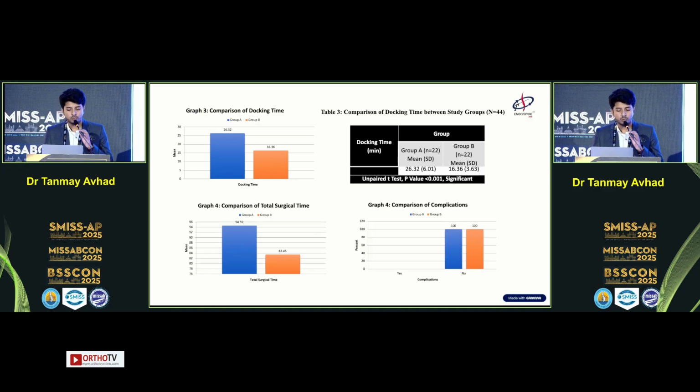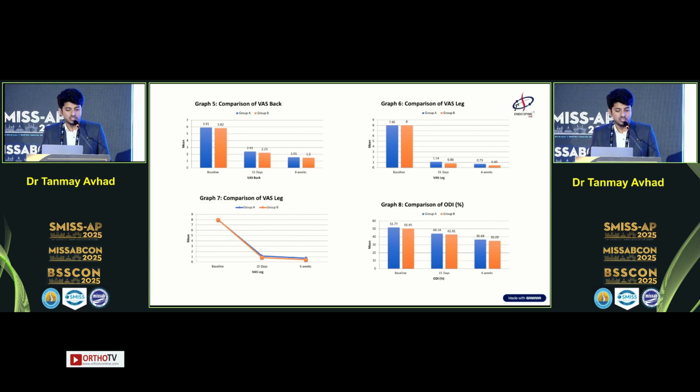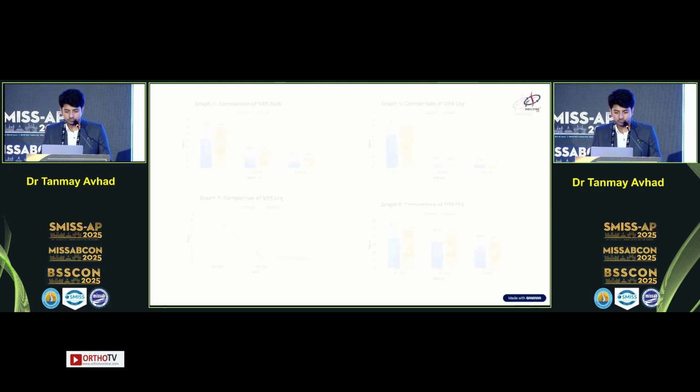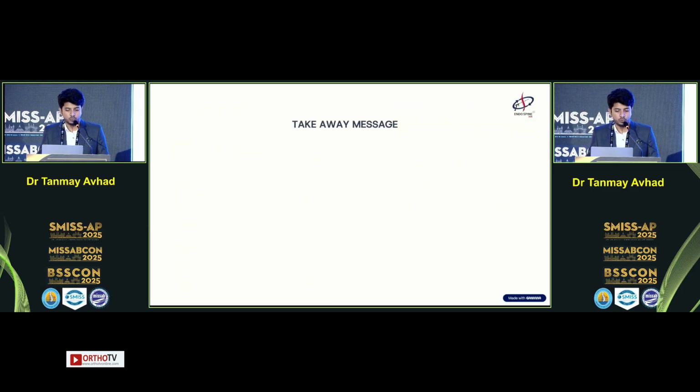There were no complications in either of the groups. What we noticed was that the VAS and ODI scores were comparable between both, indicating that it was indeed a safe alternative. To summarize the findings: complication rates were 0 in both groups, there was definitely a reduction in radiation exposure, the docking time reduced significantly, and surgical time also reduced moderately but not significantly.